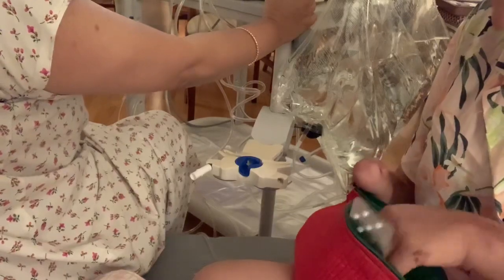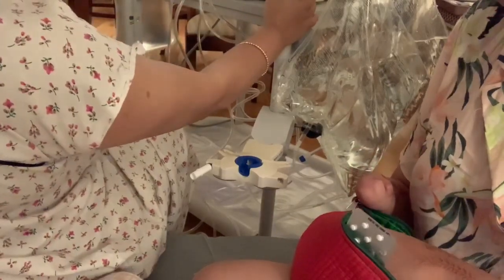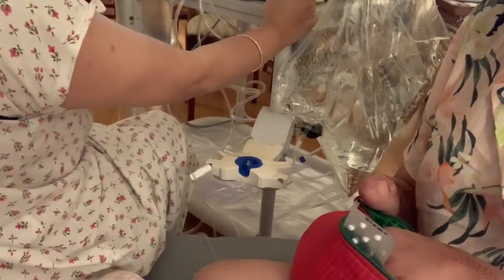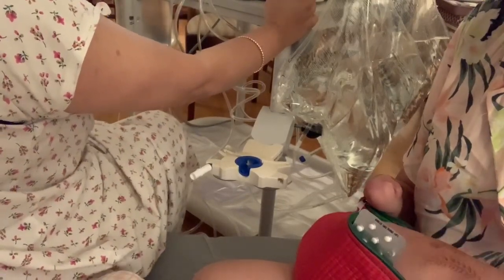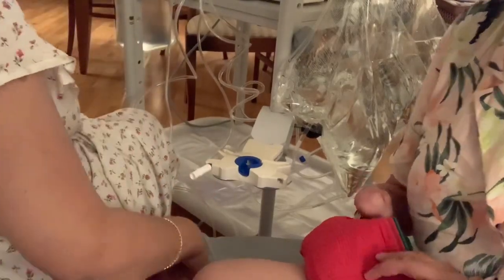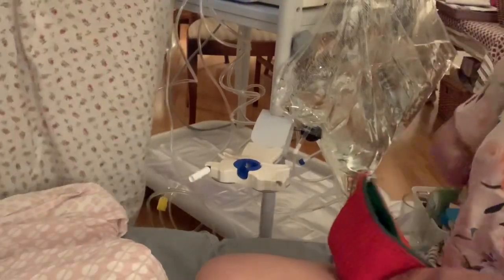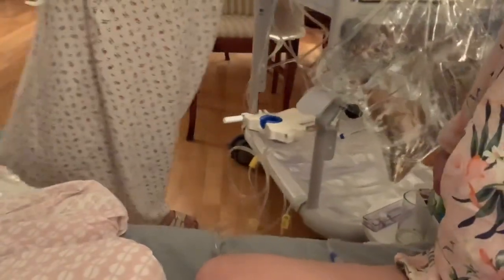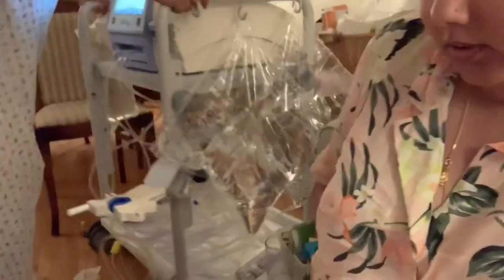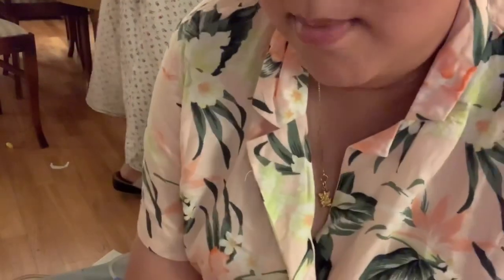Oh my god, it's already past 23:13. All right, the fluid is going back in now — I can feel it going in. Is it warm? It's always a little colder than me. Now it's going back to its place.